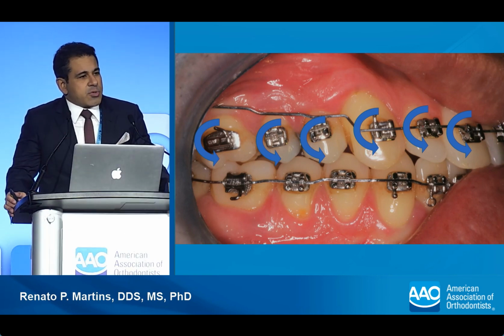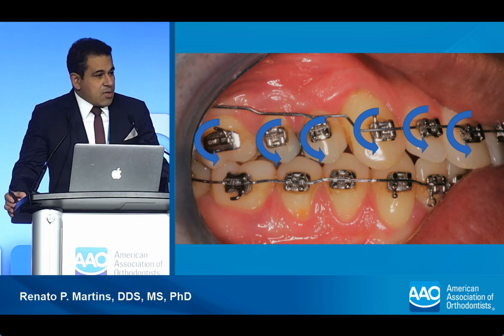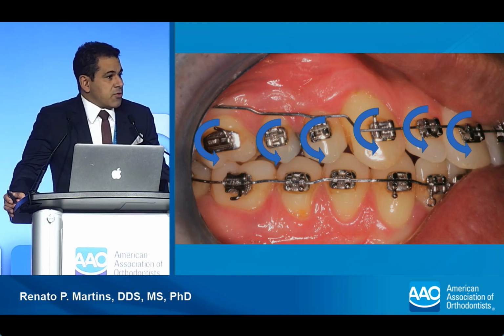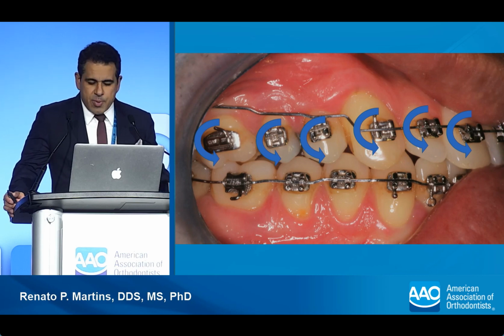And it doesn't matter if you're doing the bends, and it doesn't matter if you're bonding the brackets higher in the anterior part. The side effect of a step geometry is always going to be anterior proclination and tipping of the posterior teeth. And this can be frustrating because if this wasn't planned initially, if you didn't want a proclination of the incisors, you're going to end up having that in your patient.